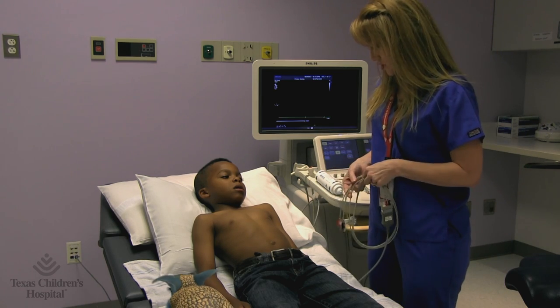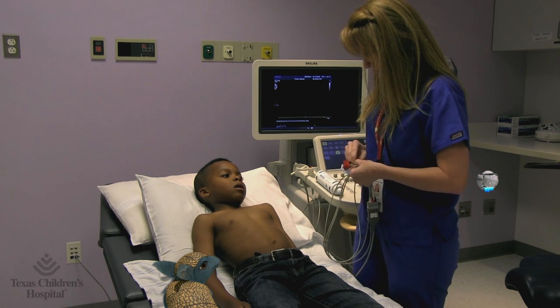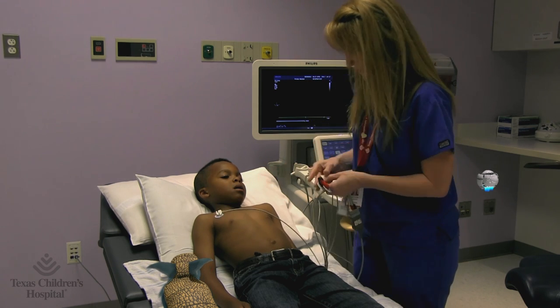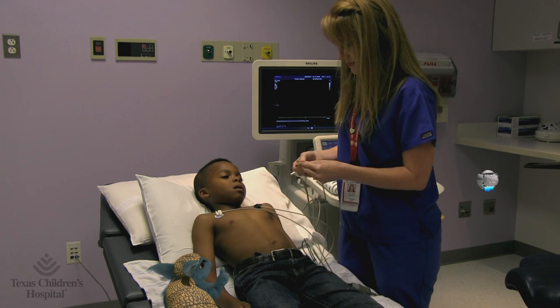We're going to put these stickers and wires on you to keep track of your heart rate during the test. They might be a little cold just because they have a little bit of glue on them. I love stickers. One near your shoulder, one on each side of your tummy.